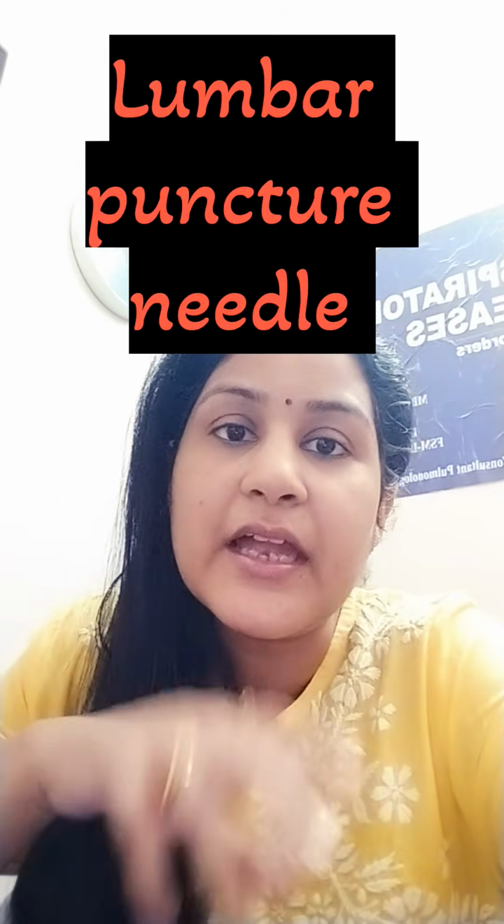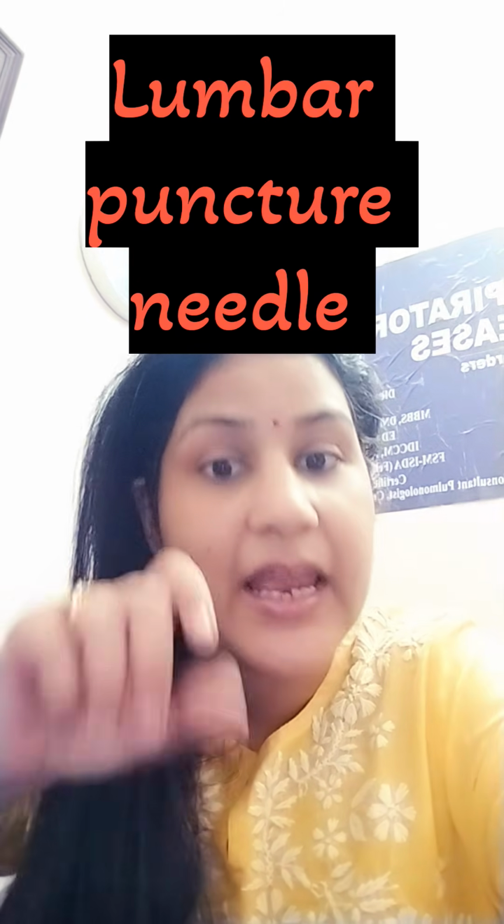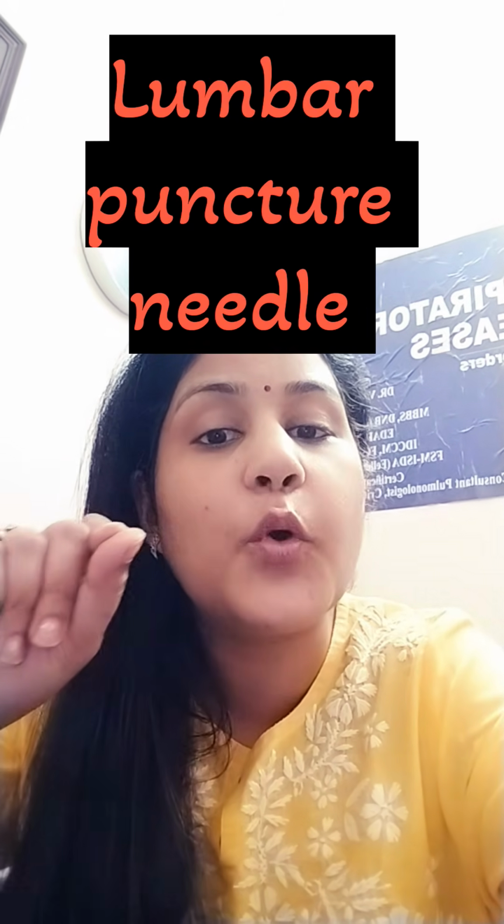Now what is this? This is a lumbar puncture needle, and the color of the needle depends upon the thickness or the gauge of the needle that you are using. So higher the gauge, thinner is the needle. One thing. Why are you using this lumbar puncture needle? You are using it for CSF examination.